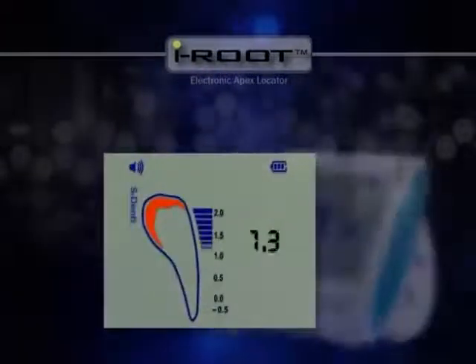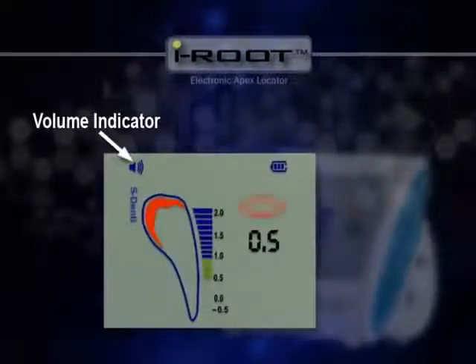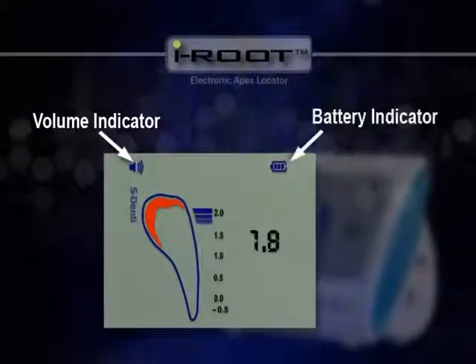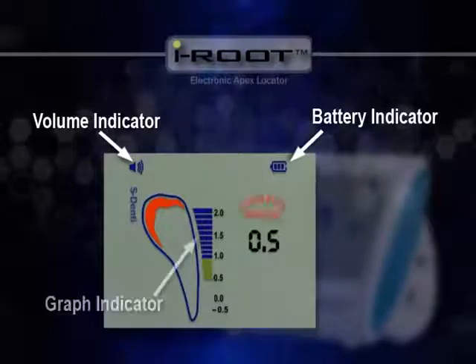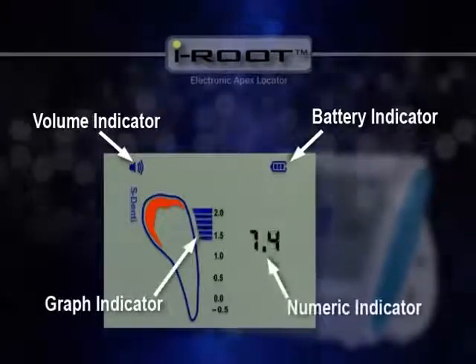Details on the LCD screen include the volume indicator on the top left corner and the battery indicator on the top right corner. Real-time progress of the file is displayed at the center of the screen.